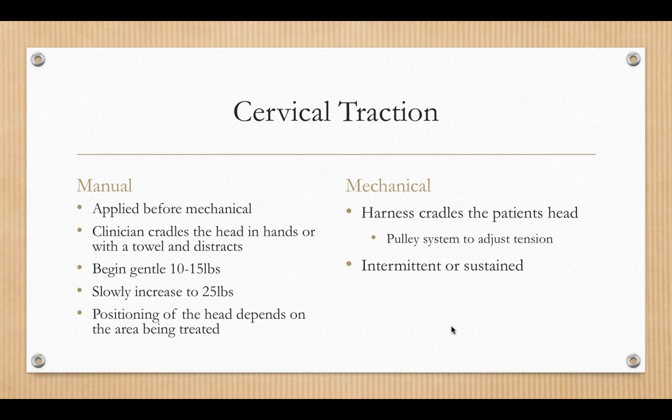So we have our patient lying supine. That's preferred over sitting because it eliminates the effect of gravity, right? If you're seated, gravity is pulling the head down, and the spine musculature is contracted around the neck. So supine is the best. It increases the relaxation of the patient and decreases muscle guarding.